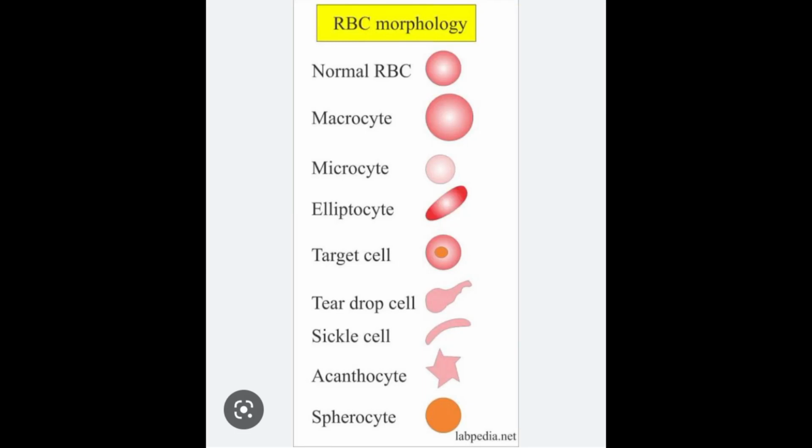Morphology of normal and abnormal RBCs. Normally, RBCs are biconcave disc-like with a diameter of 7.2 micron. These are uniformly stained and also known as normochromic, normal color. The mature erythrocyte contains a central pallor area, edges are quite thick, containing hemoglobin. Normal RBCs are non-nucleated. The normal morphology of RBC is termed normocytic, normal cells.